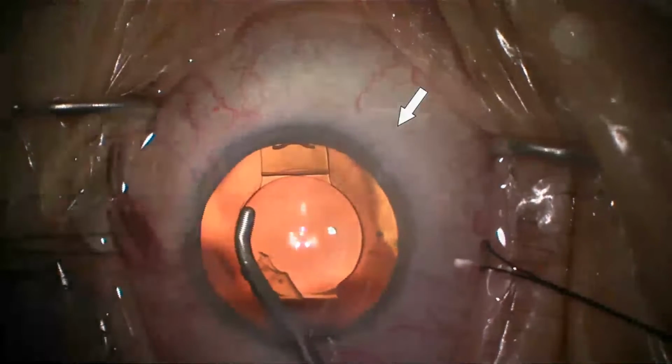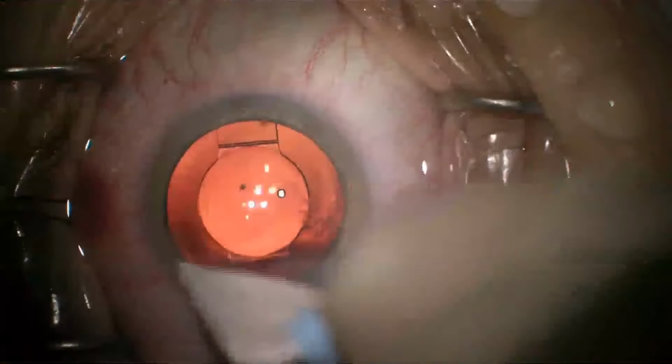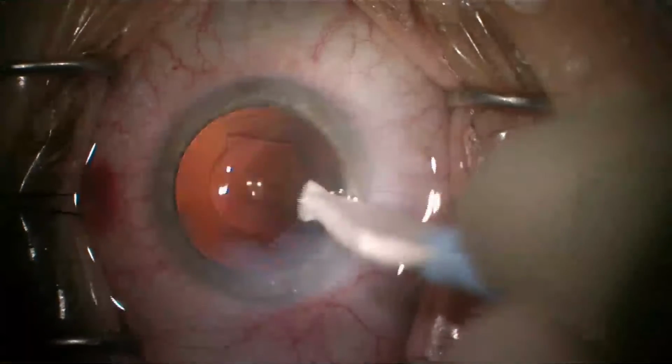You can see here in slow motion how the blanching of the episcleral perilimbal vessels occurs. And in fact, if you look at the still on the left, just before we're removing viscoelastic, up top, even that smaller blood vessel there is now blanched and gone after removing the viscoelastic.